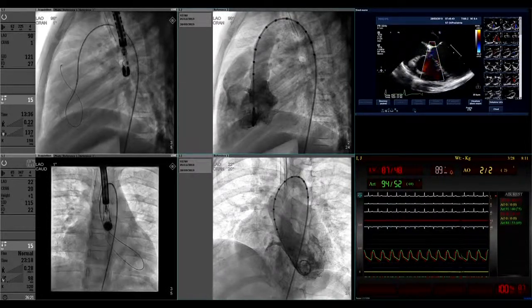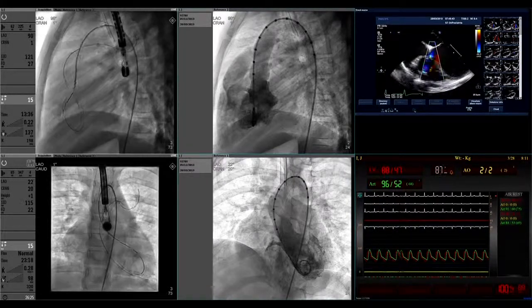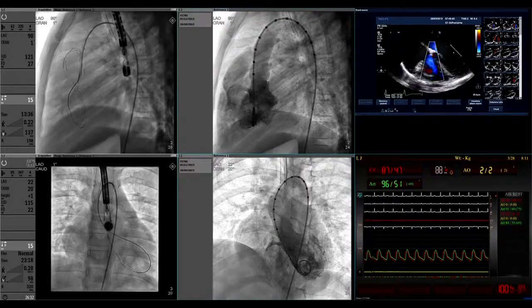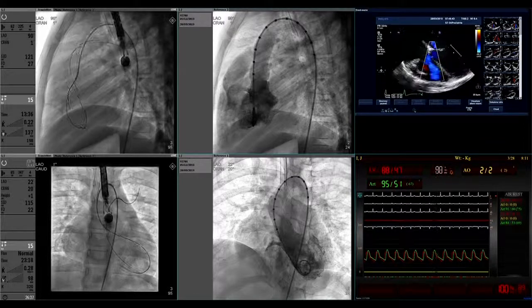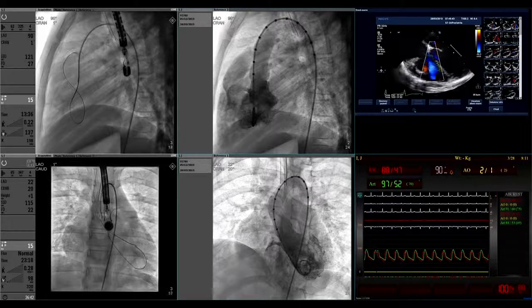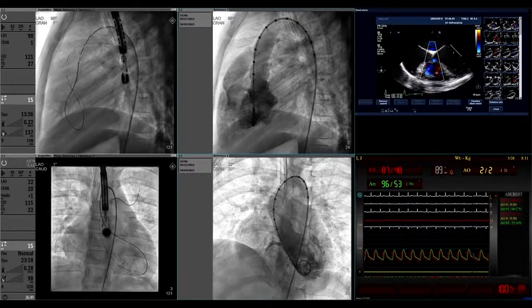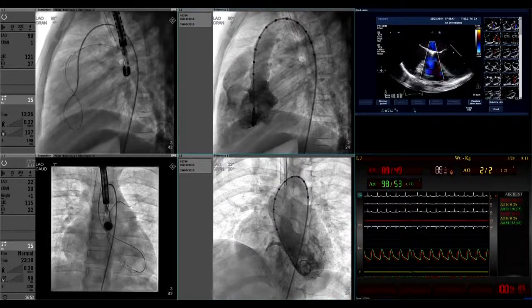I agree you can deal with this in both ways, antegrade or retrograde. Carlos, you mentioned 2 discs, and obviously doing a retrograde and ADO2 would fit in very nicely. Would you consider an ADO1 from a venous side? The ADO2, you mean? No, an ADO1 from the venous side, just to not have anything close to the tricuspid valve. Yeah, that is another good option. If you are taking an AV circuit, I think ADO1.